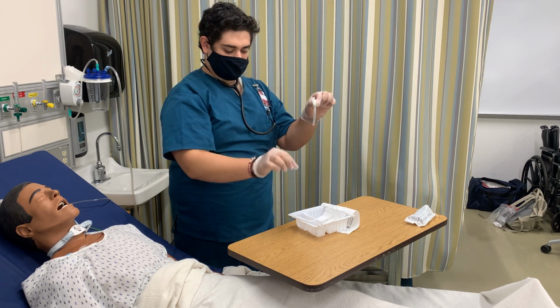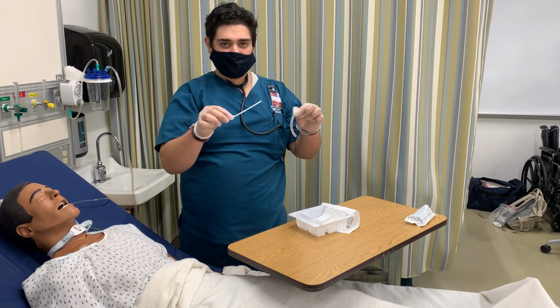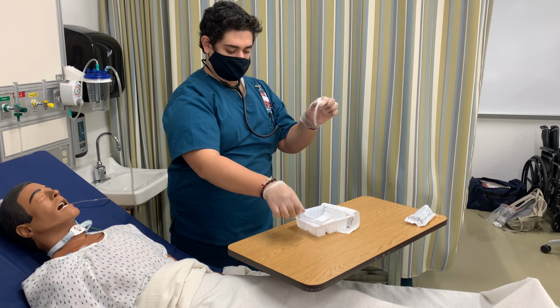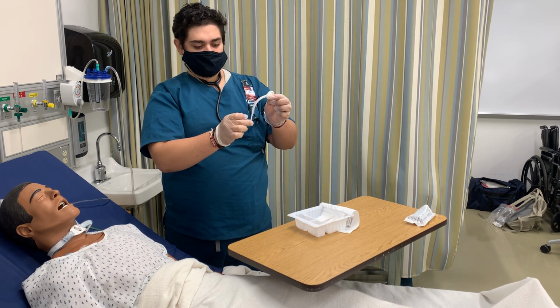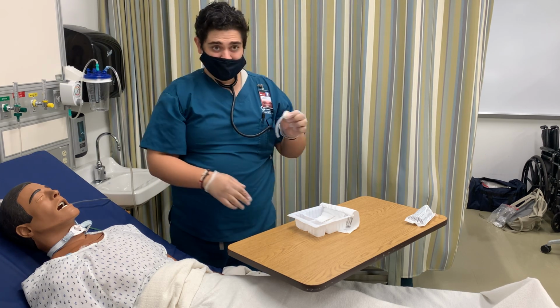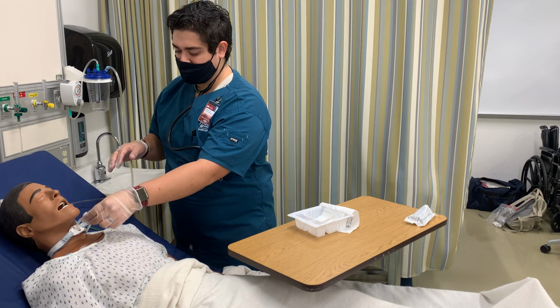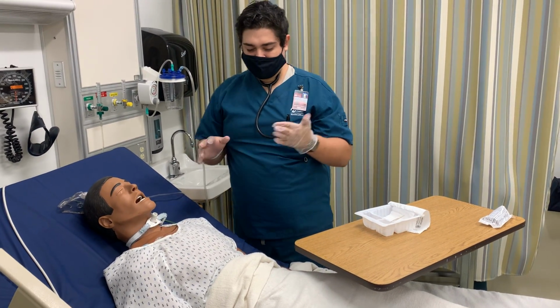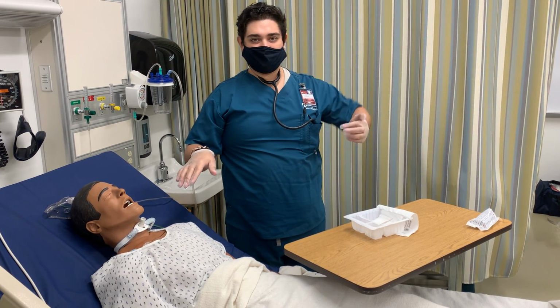Okay. And then drying it off with my pipe cleaner. Okay. I will now reattach my inner cannula. Here. I am no longer sterile, but I could continue to assess Mr. Doe here.